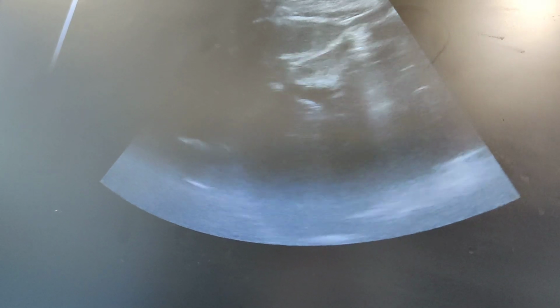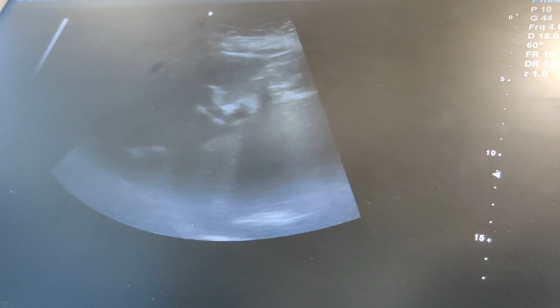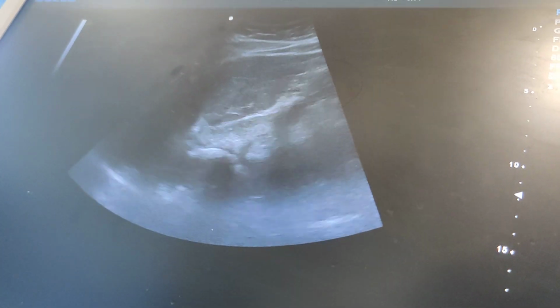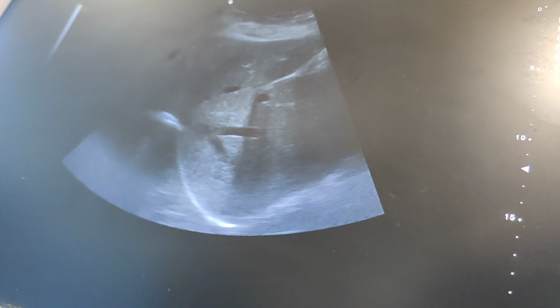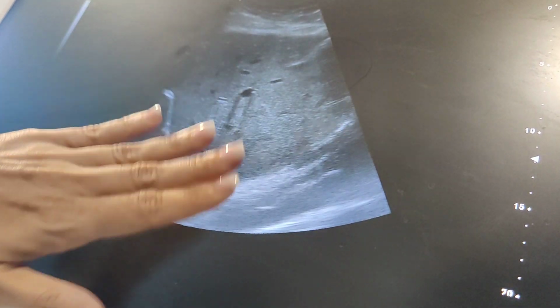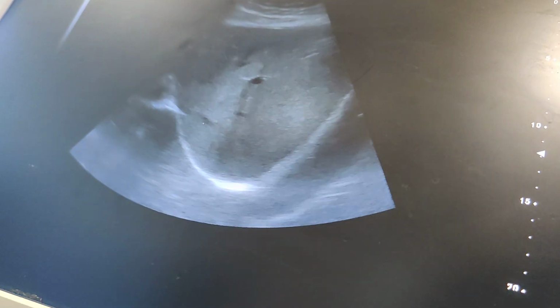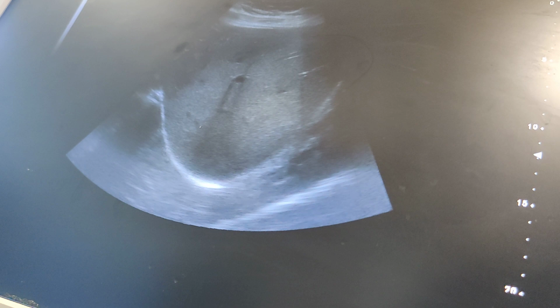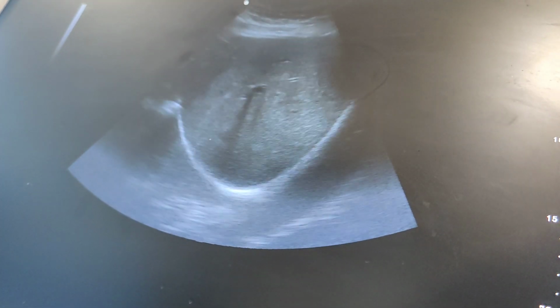I always take one picture of the right lobe here. When I'm imaging, I drop my focal zone down if you have a focal zone, because we're going to look at the posterior portion of the liver. So take a big deep breath in. And I can see here, decrease my depth a little bit more. The right lobe looks pretty smooth, homogeneous. You see it here. So I just sweep through. This is not where I take my measurement, though.